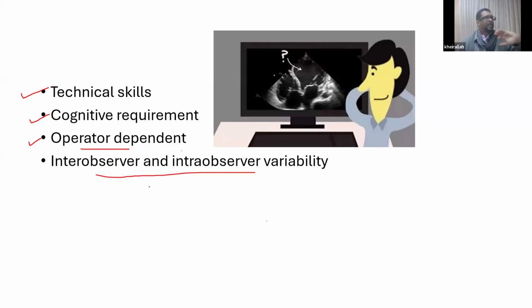This is called inter-observer variability. لكن الانتر-observer variability should not be wide. وجزء من الكواليتي assurance and quality assessment for any echo lab انه الانتر observer variability يكون المارجن او الجاب حقها very narrow لانه اذا echocardiographers in the lab are giving different answers to the same image معناتها في مشكلة، يا إما في الإيمج يا إما في الإيكوكارديوغرافر في مشكلة كبيرة. الانتر اوبزرفر variability yes is acknowledged and recognized and appreciated لكنها shouldn't be wide.